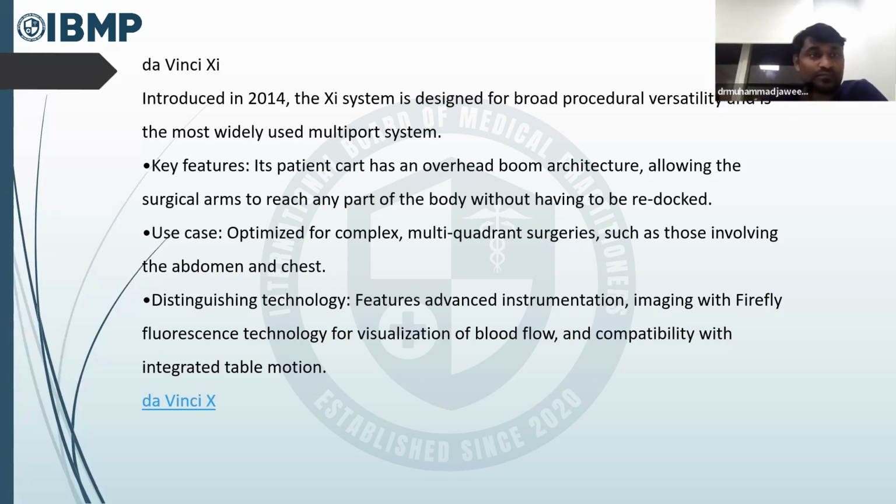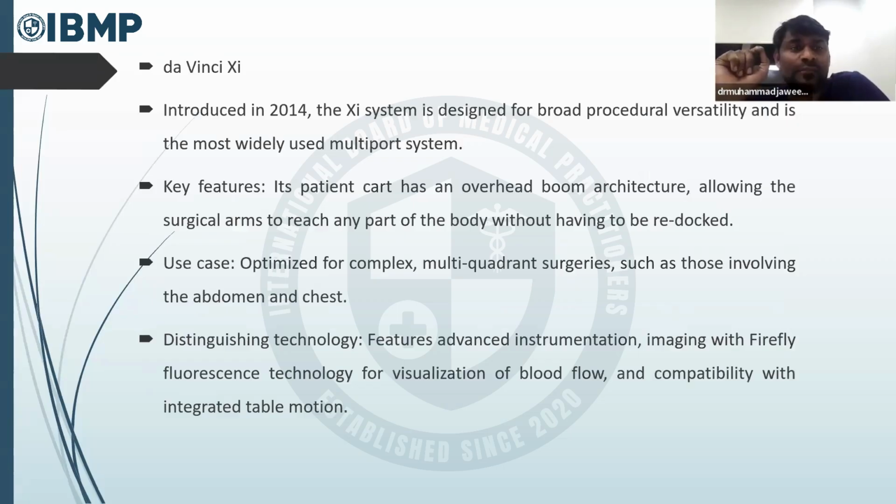Now coming to Da Vinci XI, it was introduced in 2014. The XI system is the same as I've already told you. The technology has evolved. Now it has been established in such a way that the depth perception will be more, and more technology has evolved in Da Vinci XI.